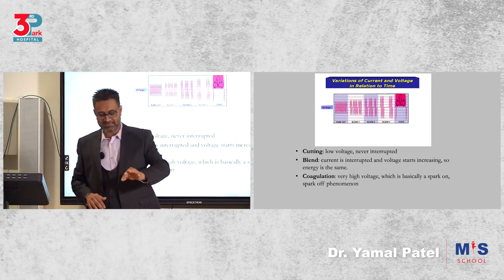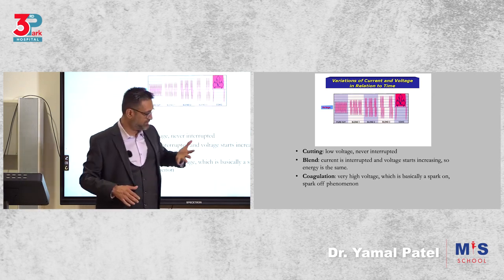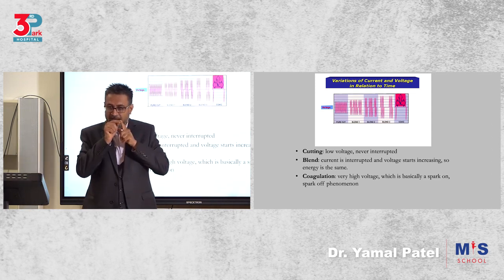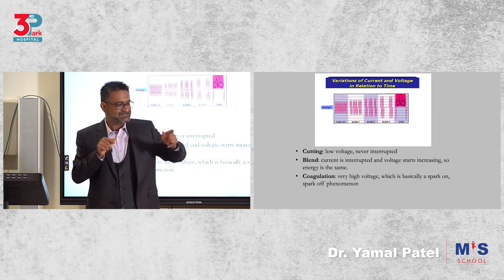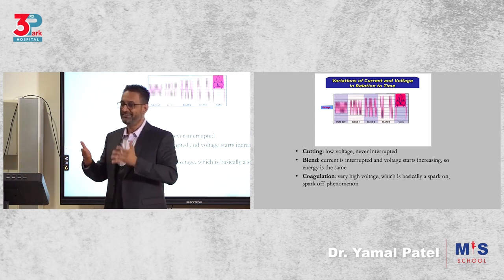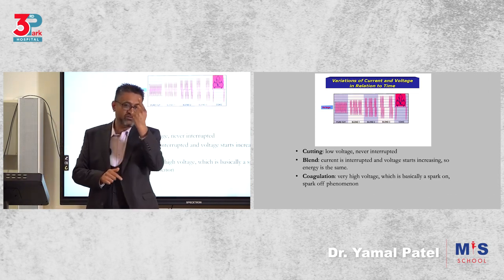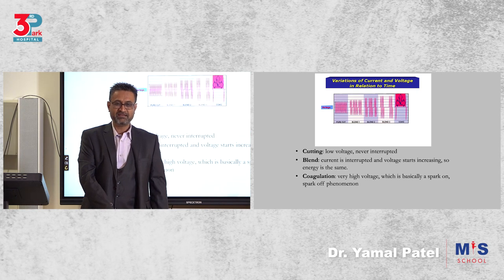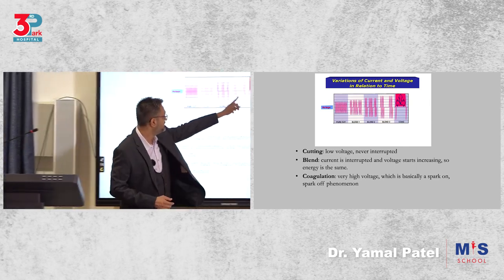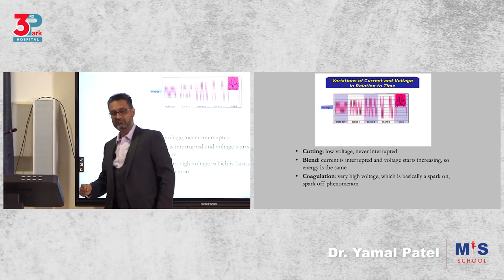When you buzz it with the blue, sometimes you must have seen or heard or experienced it yourself, where you suddenly throw your instrument and it will have caused a burn here. You remove your glove and you'll see a small burn. And what is your answer going to be? These low quality Chinese gloves, all right? And the issue was not low quality Chinese gloves. There was no hole in that glove. It found an exit through the glove, through you, out. You've understood what I'm saying? So it's because you used a very high voltage. The high voltage, this end is almost 6,000 volts, and it's like a lightning strike on and off, lightning strike on and off.